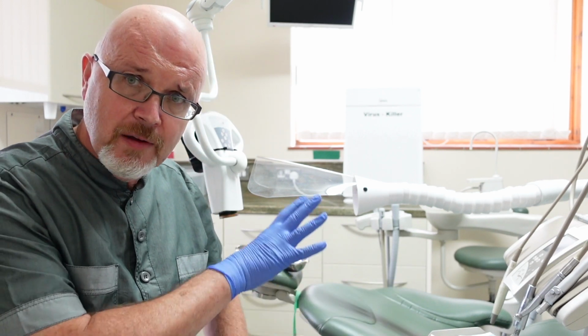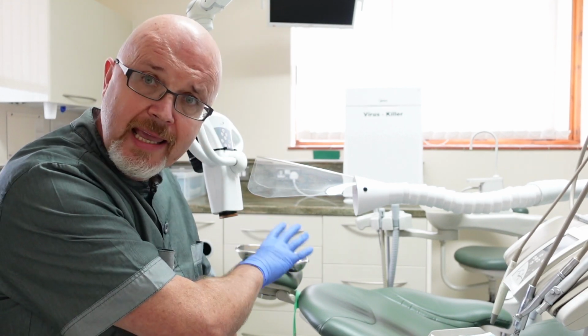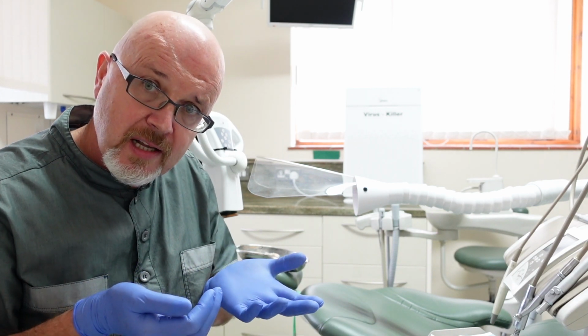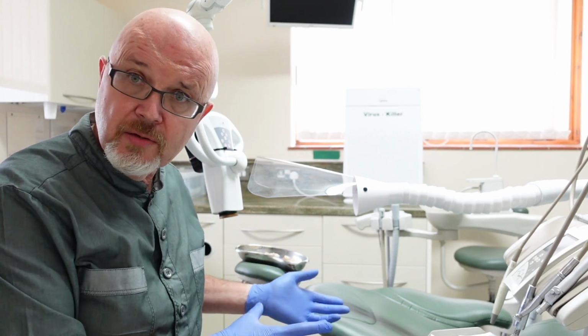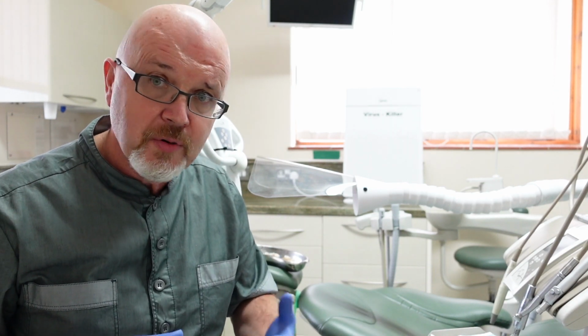That said, if we can actually eliminate aerosol, rubber dam goes a long way to eliminating the aerosol coming back from the saliva in the back of the throat. Then we've got things like the Isolite system as well, that will do something very similar and allows you to work on a whole half of the mouth at a time, which I absolutely love. It's fabulous, the Isolite. If you haven't seen it, I'll probably do a video on that as well, as I'm getting into this.